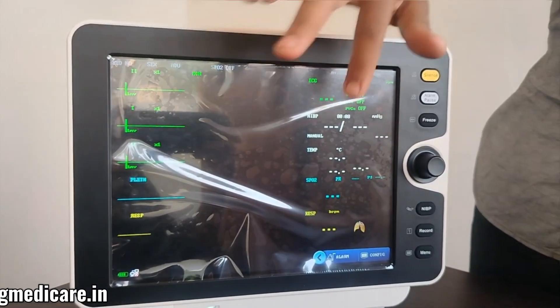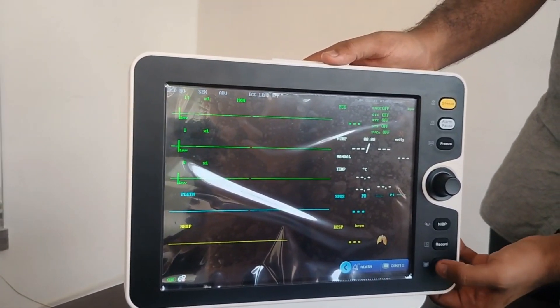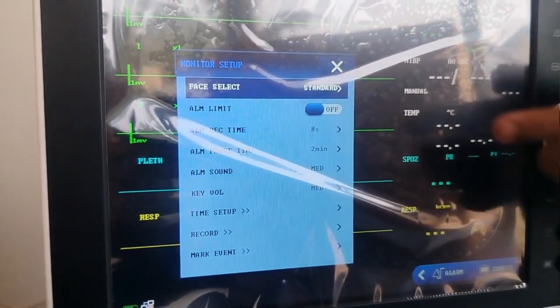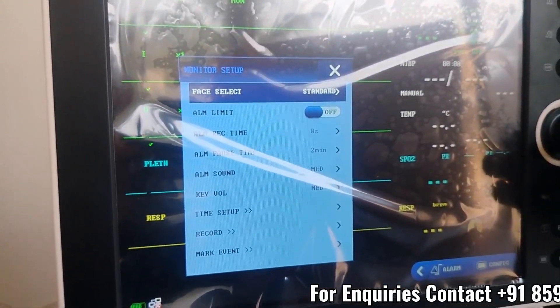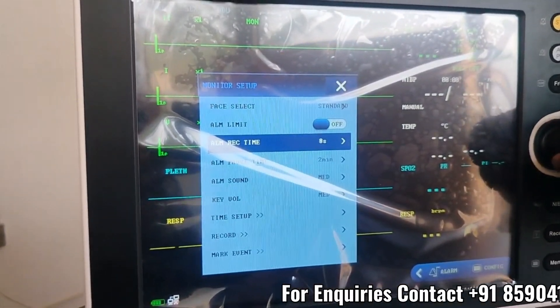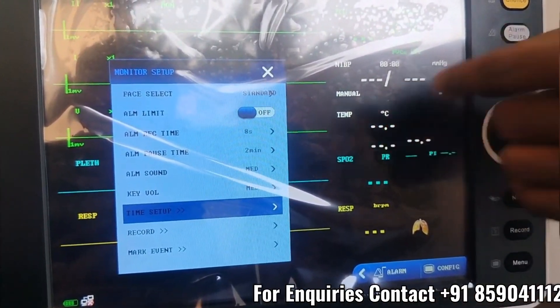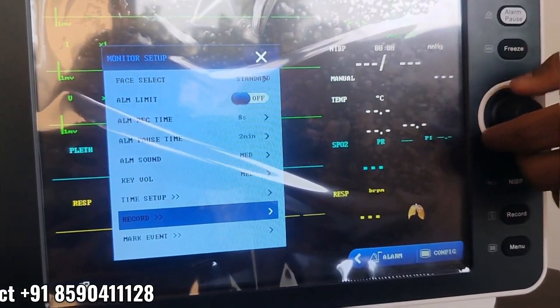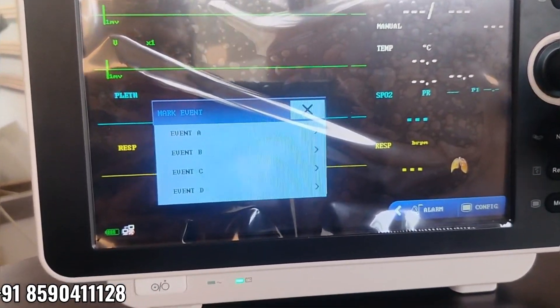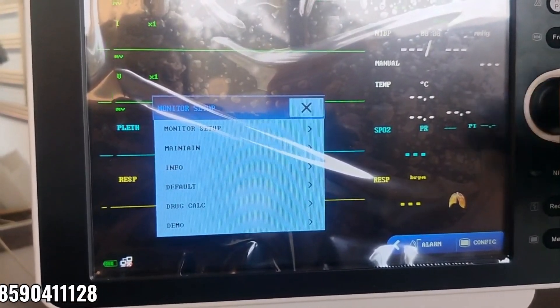Now we can see this is our home screen. Now we can select menu options. If you click, you can see monitor setup. Just click, and you can select your screen size — standard screen or OxyCRG screen. You can turn on and off alarm limit, set alarm recording time, alarm pause time, alarm sound, and adjust the key volume. You can also set up time, record, see record options, and mark an event.